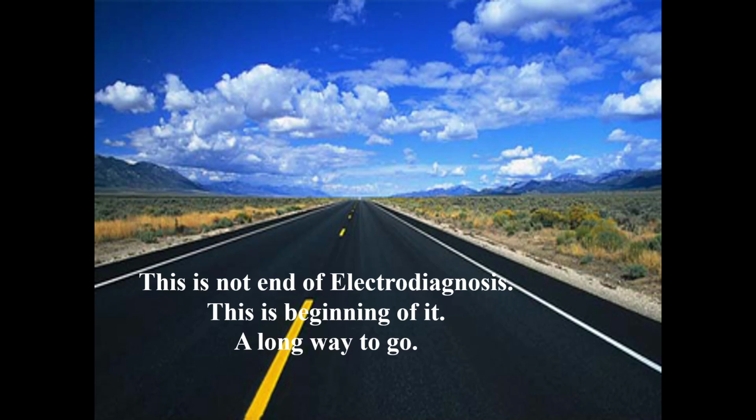In acute condition, clinically the patient will be having more symptoms. So if you take any clinical scale for the assessment, it will show more problem. Electrophysiologically, it will show less problem. But in chronic condition, the patient has adapted, so clinically it will give less problem if you check by any assessment or scale, but electrophysiologically it will show more problem because there are permanent structural changes.